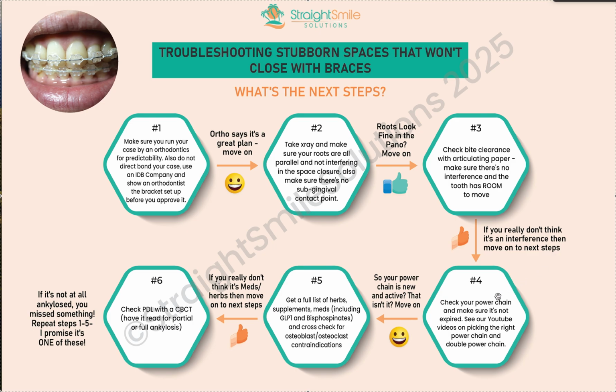Check your power chain. A lot of times, a lot of doctors are working with some junky power chain. Power chain expires after about a year. You have to throw it out and get new ones. So I have a video on my YouTube channel about checking for expired power chain. You could put the keyword in expired or power chain and it should come up. You'd be surprised how often this is the issue. Throw them all out, get new ones, and make sure you're using the right size power chain for the case.